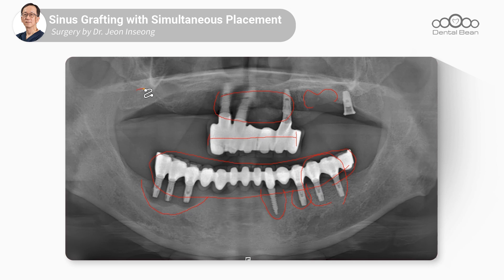Today, we plan to place implants in the right upper jaw. Currently, there isn't much residual bone in the sinus. We will approach laterally and place two implants to align with the lower jaw, and the rest can be done later.